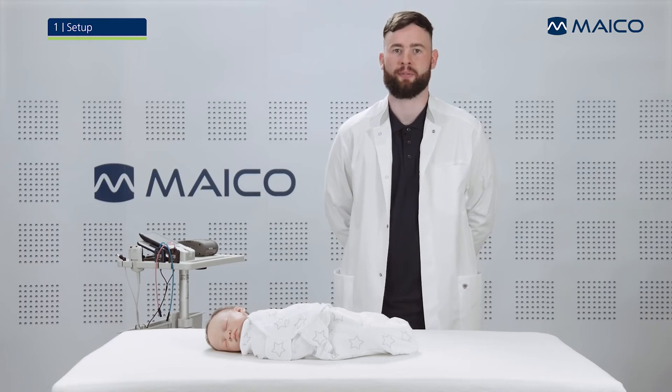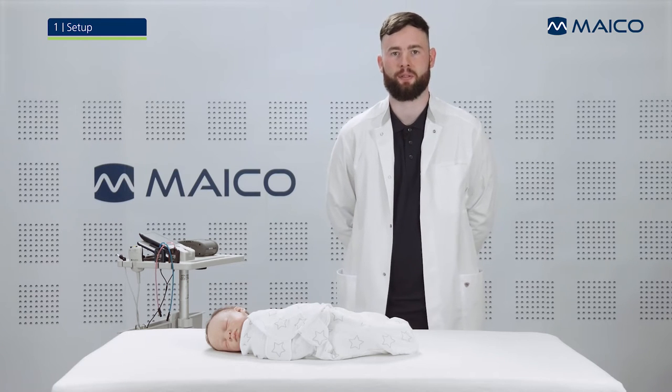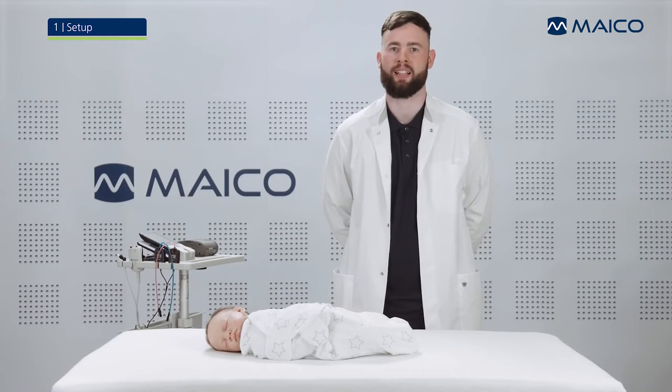This video will show you how to perform an ABR screening using the MAICO easyScreen in combination with insert phones and/or ear cups and disposable electrodes.